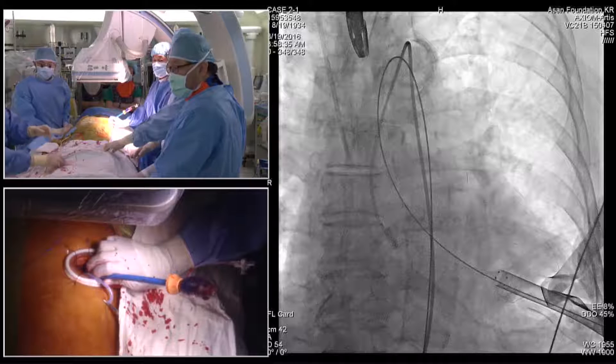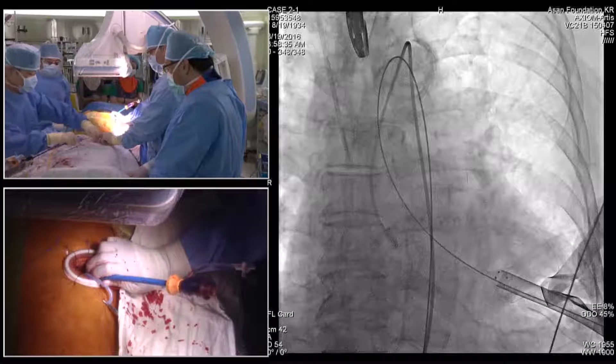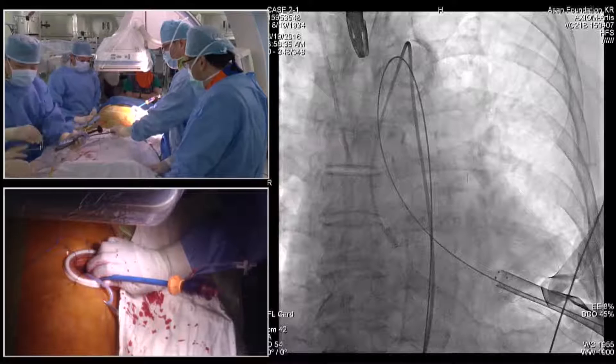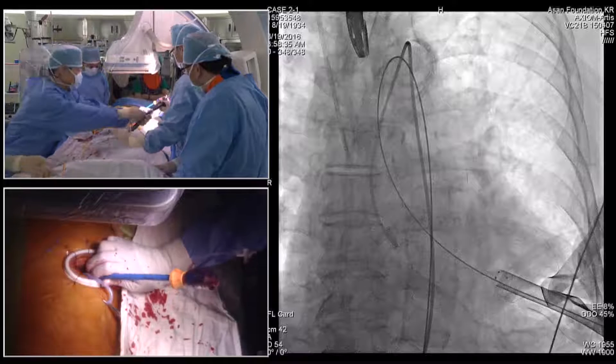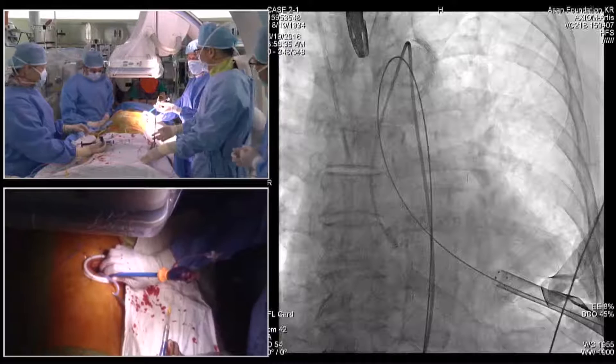We have the valve ready. It's very important to check valve orientation before insertion — even after 10 years, we still occasionally find a valve upside down, which is an embarrassing complication. Always check before inserting. Make sure the non-cuffed side will be the outflow and the cuffed side will be the inflow. That's very critical.